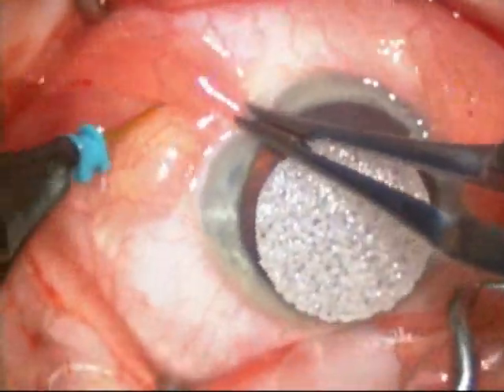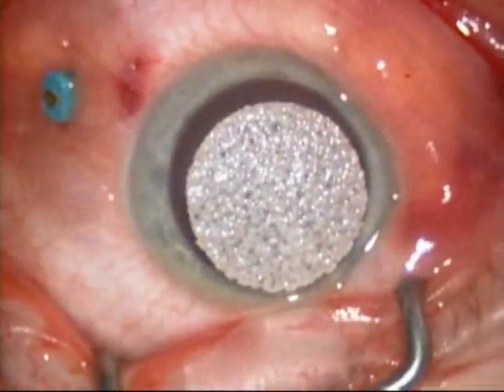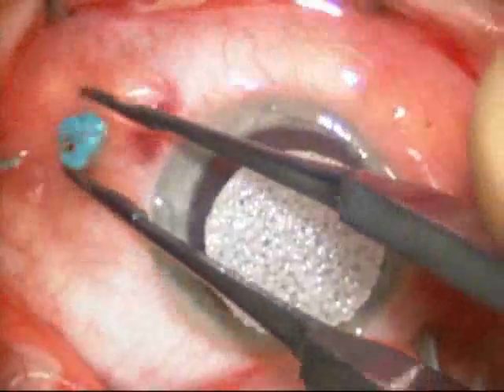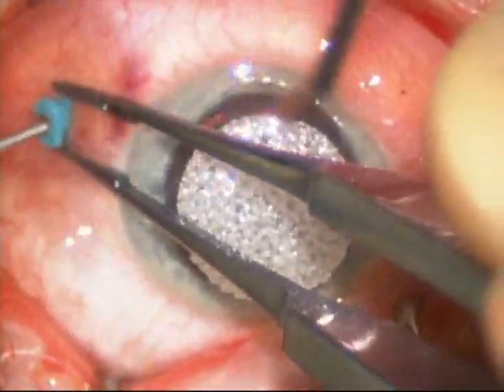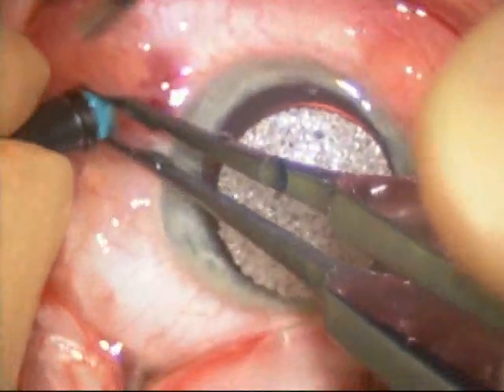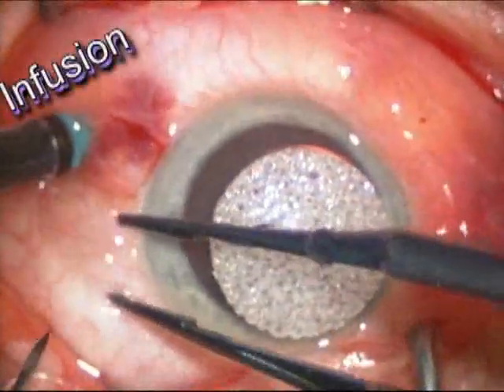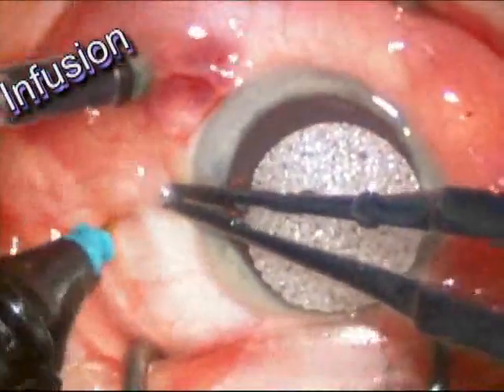This surgery will be done using a 25-gauge vitrectomy system. What you're seeing in the upper left-hand corner is a trocar being placed, and there's the infusion. The infusion will be run throughout the surgery, and that allows the eye to be maintained at a safe intraocular pressure as the other instruments are introduced into the eye.